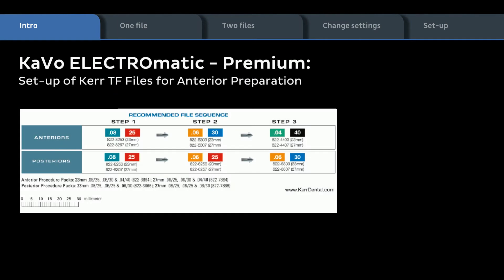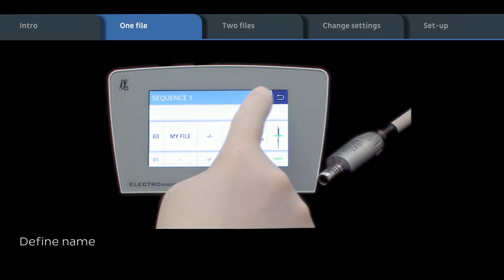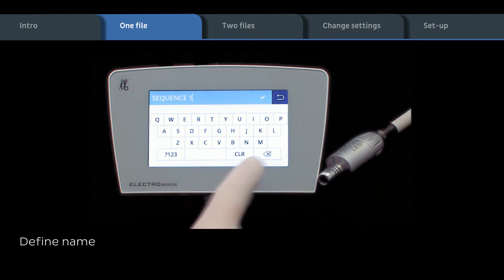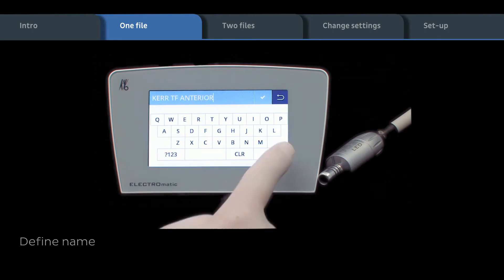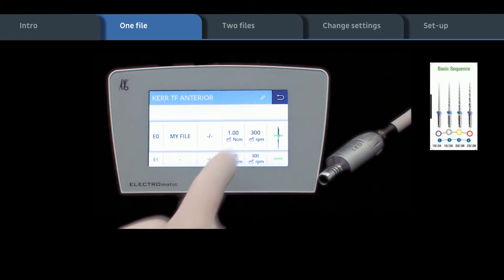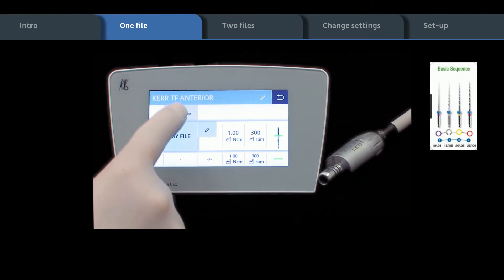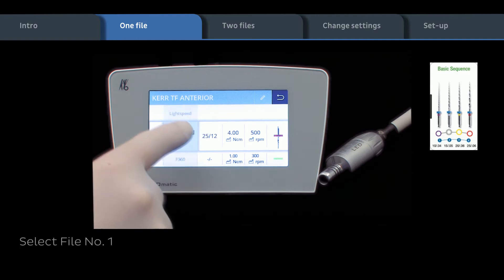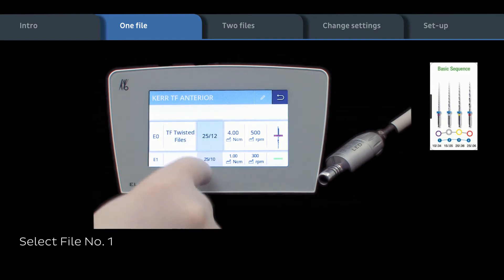As an example, we demonstrate how to set up the Kerr TF files for the anterior preparation. Define name of workflow sequence. Select file system from database, then select file type with taper and diameter.